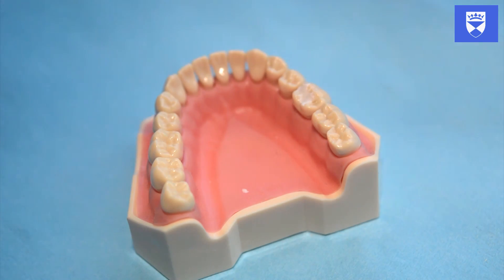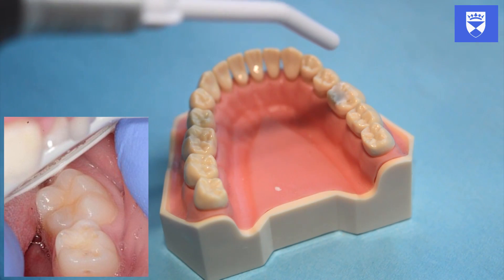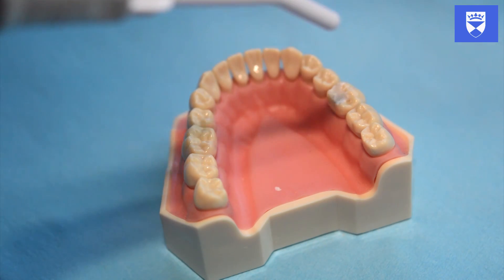Inspect the tooth under direct vision if possible, or indirectly with a mirror depending on the location of the tooth. It is important that the tooth is examined when clean and dry and under good lighting.